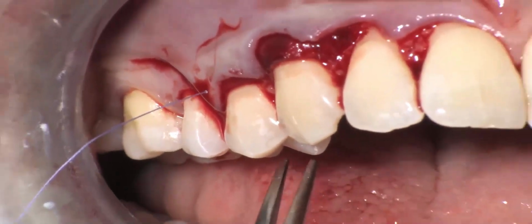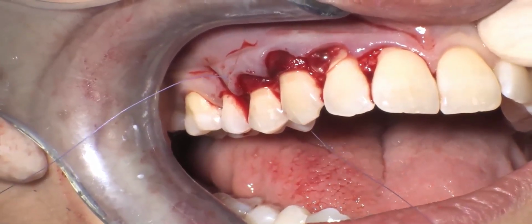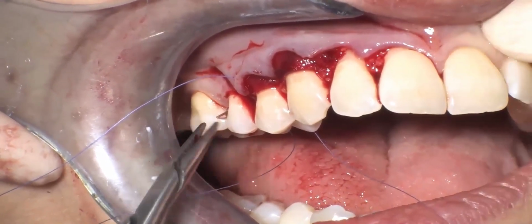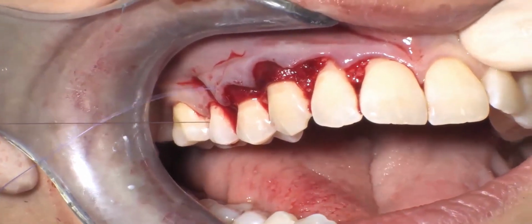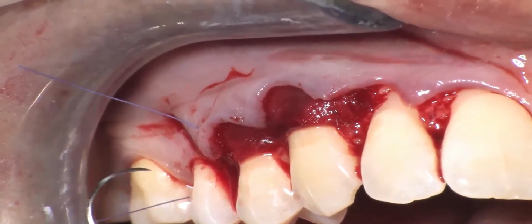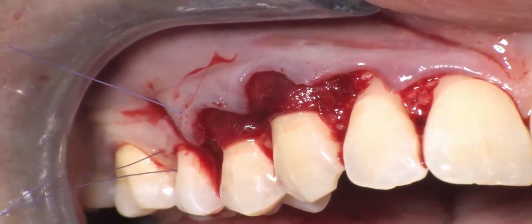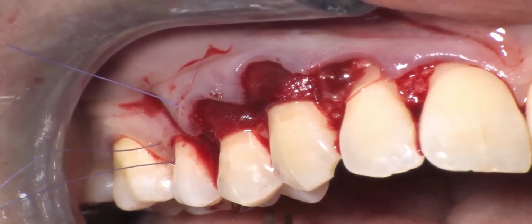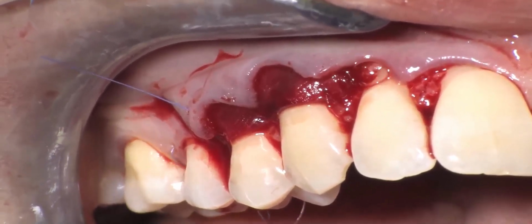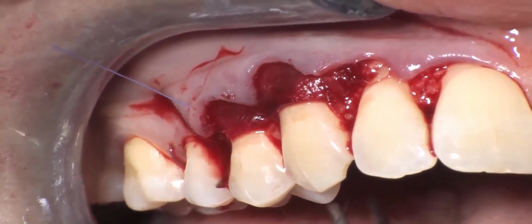in position, open, and we give anchorage to the distal papilla with a sling suture that has not been included in the flap design, because this papilla between the two premolars is going to rotate it distal. We come back to the starting point.